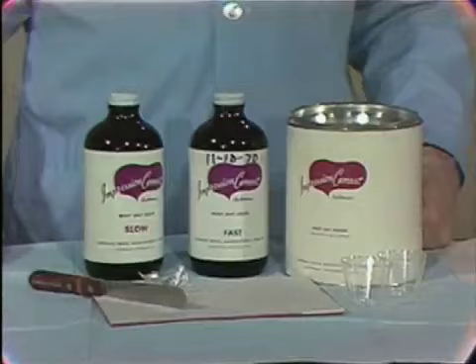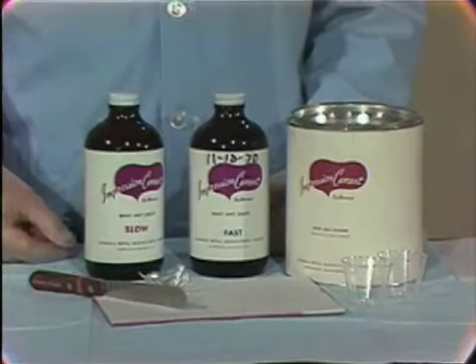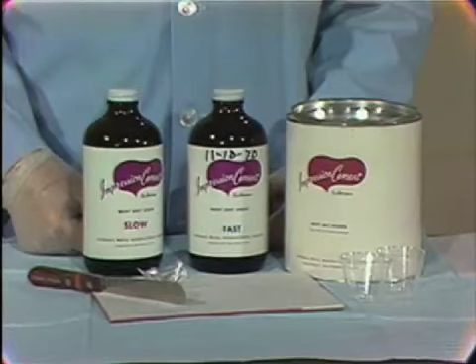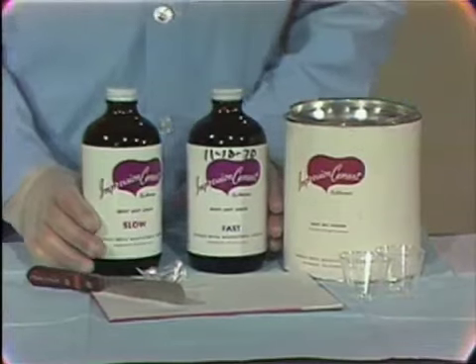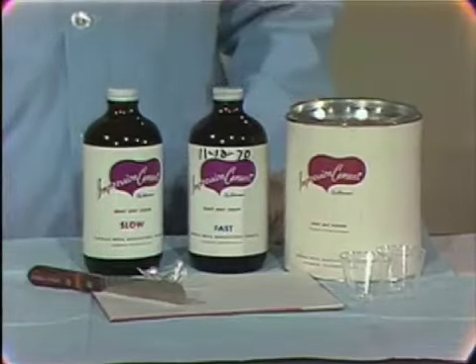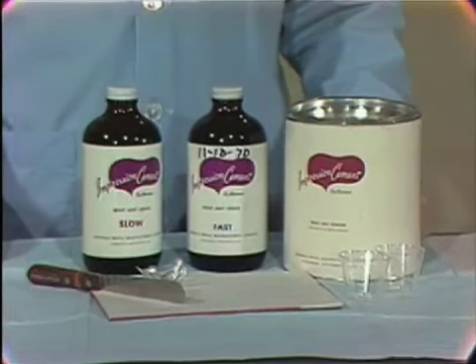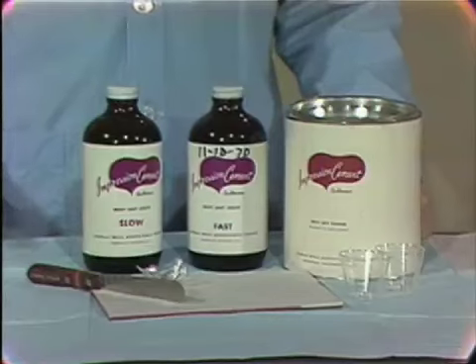To take an impression of a semi-dried, healthy ridge with the tissues in a resting state sets certain limitations on the impression material that we have available for use. So the requirements of an impression material have to be followed. The impression material must have tremendous flow properties. A material that has less resistance to flow than the tissues will not distort the tissue.